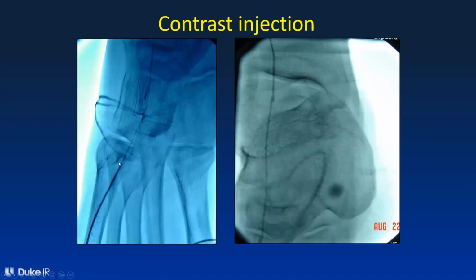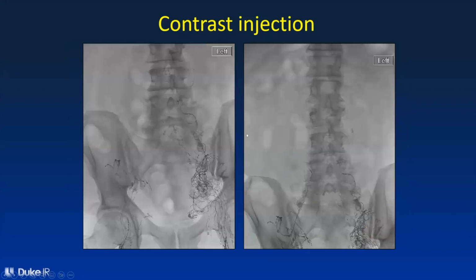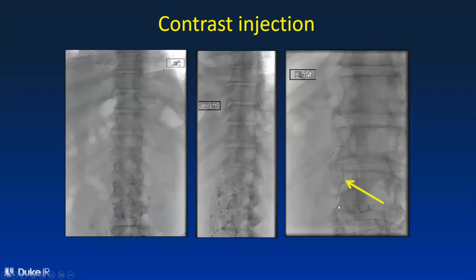These are spot radiographs of our needle in the dorsal pedal lymphatic vessel, injecting that Lipiodol dye into a lymphatic vessel. And we're watching the dye travel up the calf, up the thigh, all the way into inguinal lymph nodes and into pelvic lymph nodes. We continue to watch it travel up the lymphatic system in the retroperitoneum here, and eventually it's going to go up and hopefully make its way to this abdominal structure here, which looks like a lymphatic vessel because it's very small in this patient.